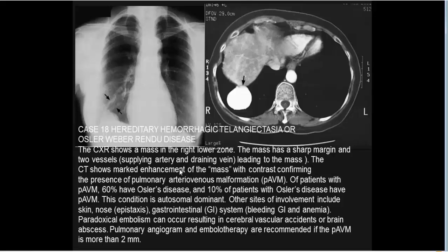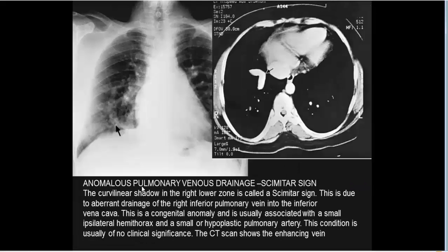In hereditary hemorrhagic telangiectasia (Osler-Weber-Rendu syndrome), a mass in the right lower zone with sharp margins and two vessels — a supplying artery and draining vein — represents an arteriovenous malformation presenting as a linear lung marking. Scimitar syndrome (anomalous pulmonary venous drainage) presents as a curved linear shadow in the right lower zone — the scimitar sign — representing anomalous drainage of the right inferior pulmonary vein into the inferior vena cava.